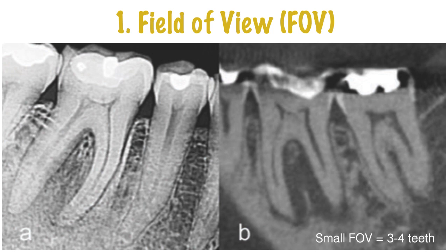You see a fuzzy area on the bone, where we can clearly see an area of low density, a radiolucent area, in the furcation area and along the roots of tooth 46.